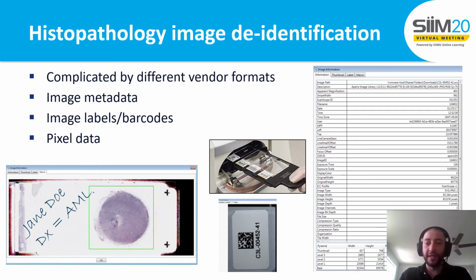In our work to date, we found that for most of these metadata fields, there's not nearly as high a risk of patient data being contained in them as there is with radiology. However, you do have to keep a close eye on the image path and file name, as we found oftentimes people will put different kinds of patient identifiers and names in those fields.